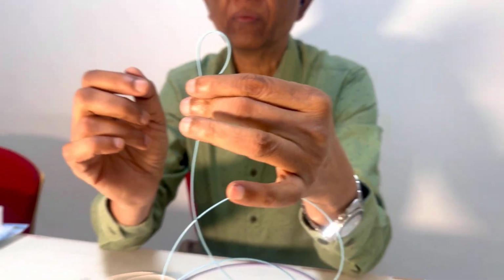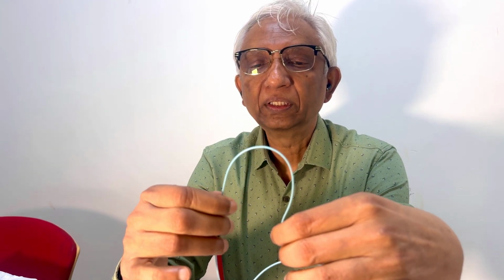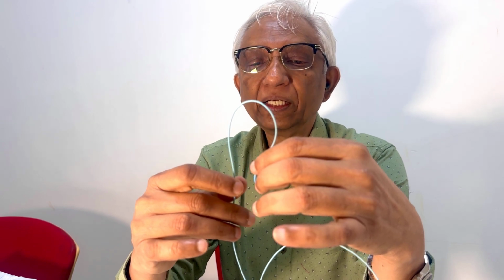So understand one very important thing: never push the catheter out. If you push the catheter out, as you try to unknot it, the whole catheter will rotate. Have you got it? You will understand. So you have to fix the tip. If you see knotting taking place, make sure one end of the catheter is in a vessel, say the opposite iliac. Then when you rotate, this tip doesn't rotate and you can rotate it out. Or you can enter into the renal artery or somewhere. So one of the key crucial things of unknotting a catheter is to get the tip fixed somewhere.